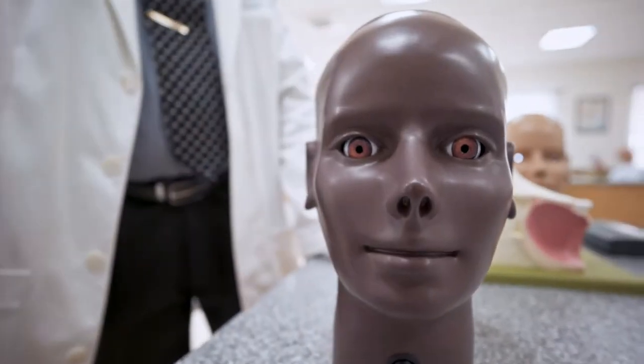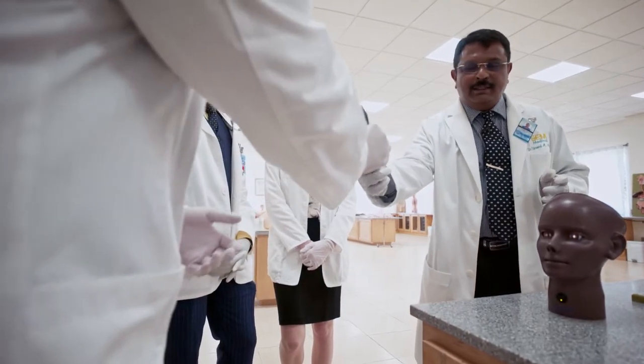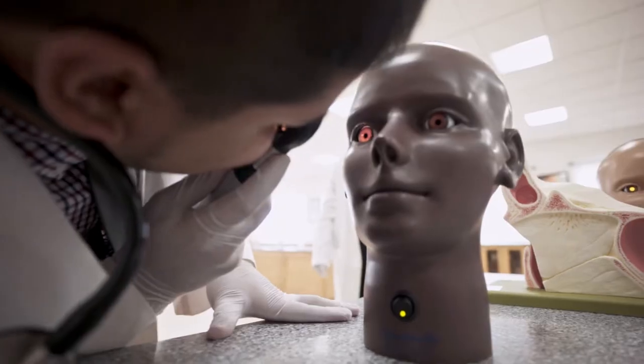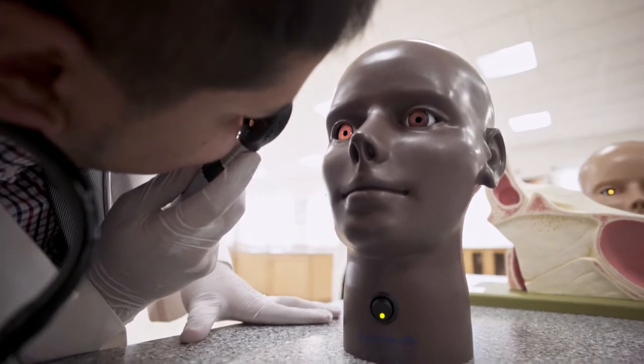What you intend to do is to focus the light on the pupils. Naturally the light is going to go into the pupils and to the retina. So do you want to come and start? You did look at the retina, didn't you?